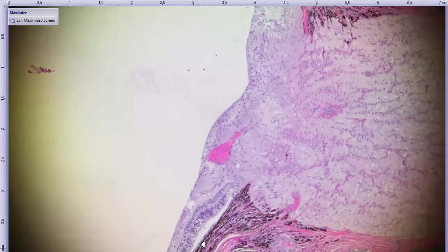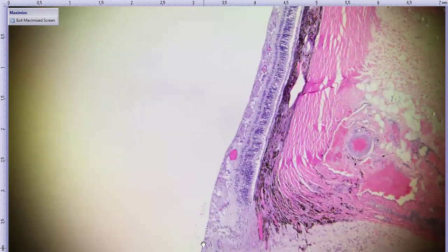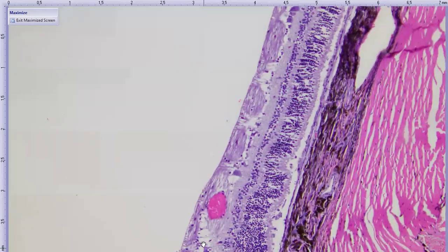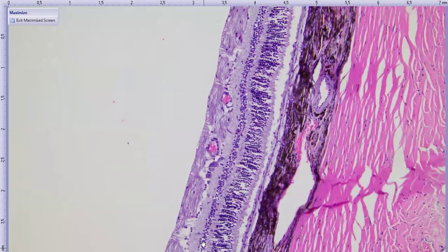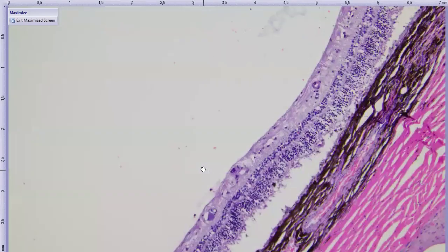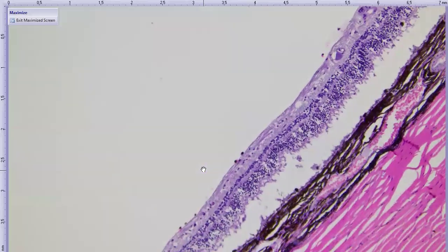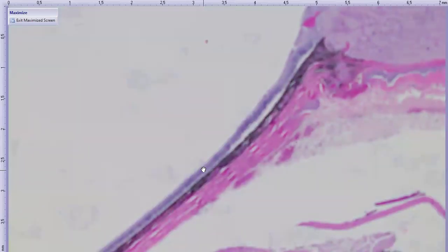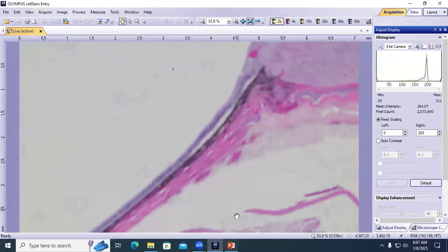We don't have the cupping or atrophy of the optic nerve head that we usually see with more chronic cases of glaucoma. And similarly, we don't see any retinal atrophy because this is relatively acute. With acute glaucoma, we can see necrosis of these individual ganglion cells, which was not a feature in this case. They look pretty unremarkable in this case, a pretty immaculate retina. So I think those are the main features here.